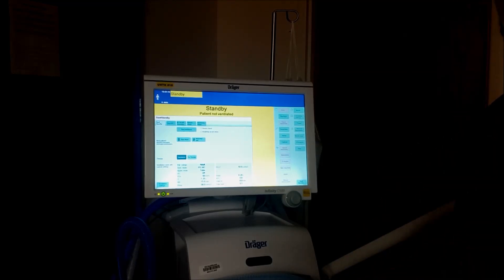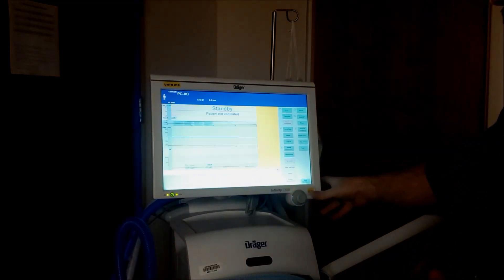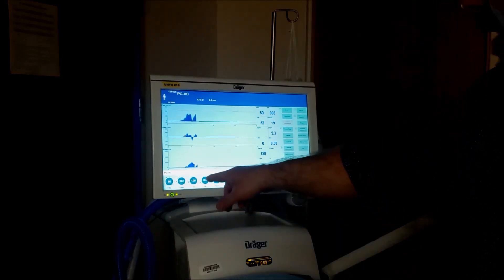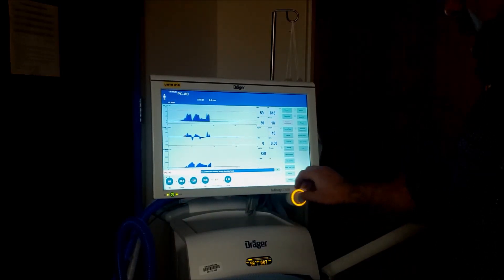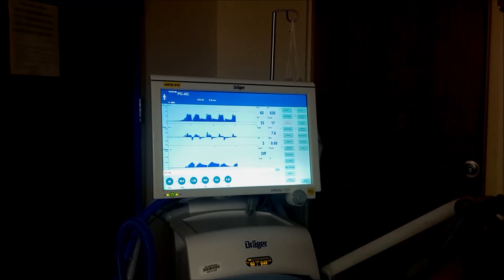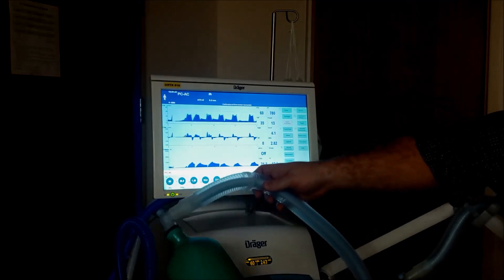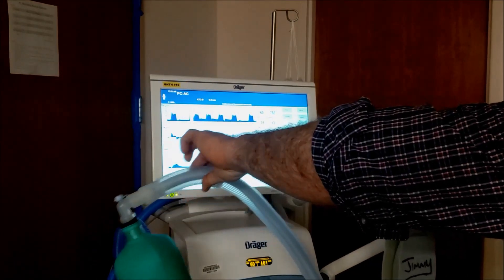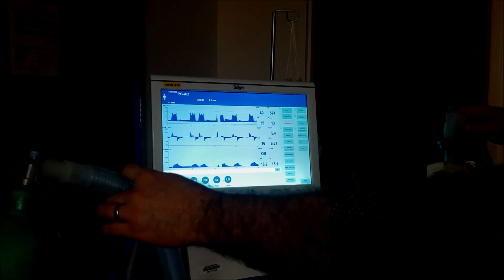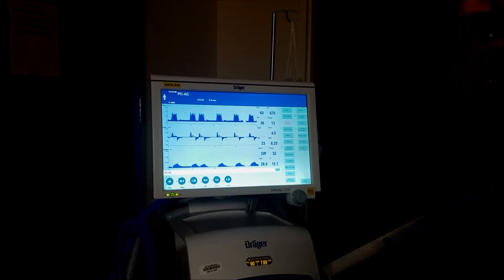So we're going to go to assist control, but we're going to do PC assist control. Turn on the vent. You're going to see PC assist control coming up right here at the top. I'm starting with high pressures — starting at 30, rate of 15, PEEP of 10. I'll take that down a little bit. Right now with that easy setup, we have both of these patients running — one on this side, one on this side — and you're ventilating both. They're not going to be taking any spontaneous breaths because you should have sedated and paralyzed them at this point.